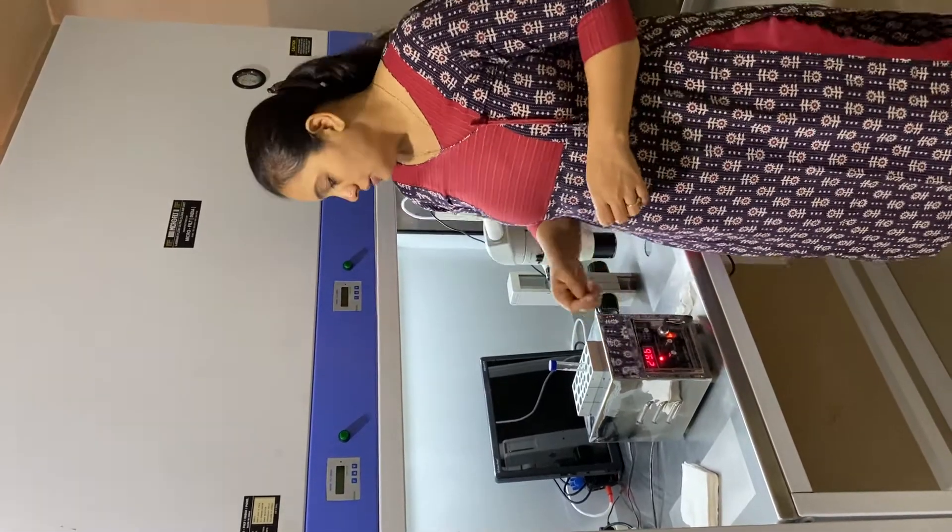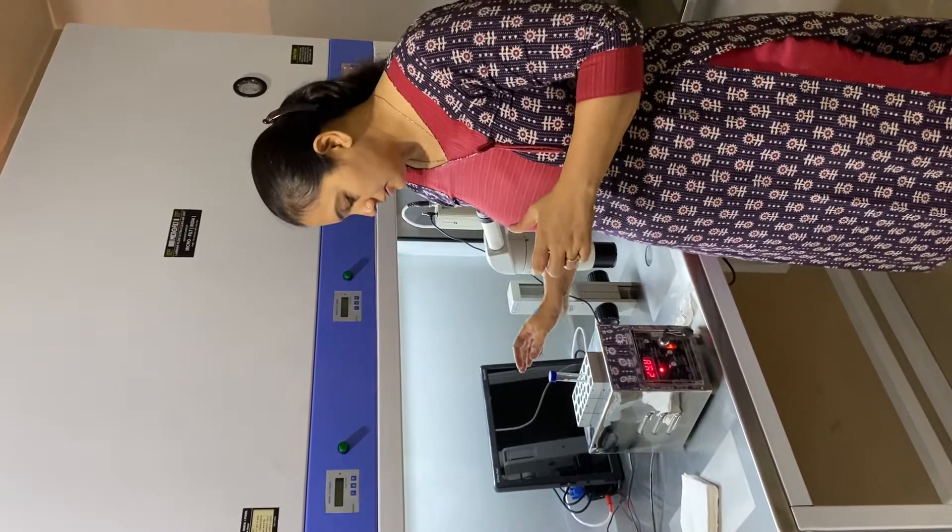Today I am going to show you how to load an IUI catheter. This is a prepared IUI sample. Now we are going to load the catheter, and it is very important how to load the catheter correctly.